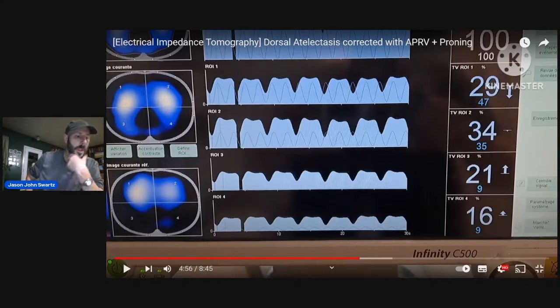So when I did stimulate her at one point and change the head position, she started to react, and she started to breathe and take in breaths, which was actually quite useful because I was able to look with the P high of 30, and I could see the spontaneous inspirations, even with quite a high P high. She was able to suck in some decent tidal volumes. So I was quite encouraged by that.